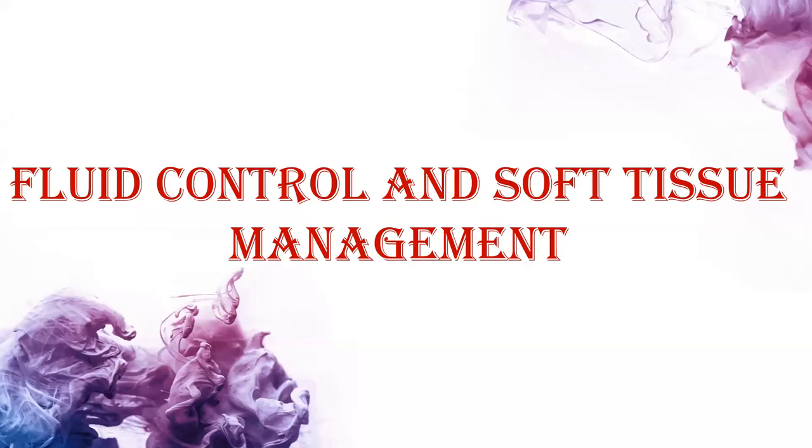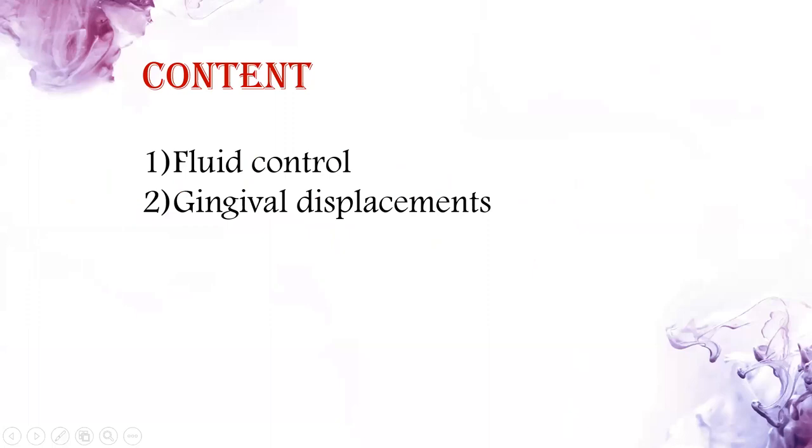Fluid control and soft tissue management. Control of fluids and appropriate displacement of the gingiva are essential during tooth preparation to obtain accurate impression and for cementation. They enhance the operator visibility, increase patient comfort, and aid in extracting optimum benefits from the impression and cementation procedures. The various procedures used in control of fluids and gingival displacement are discussed in this video.